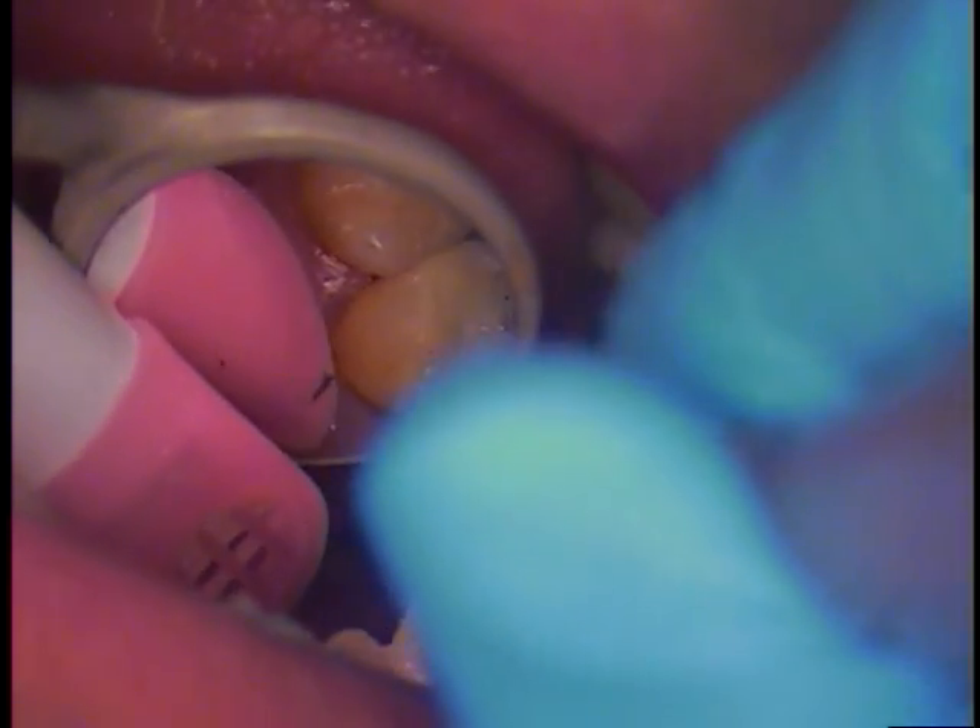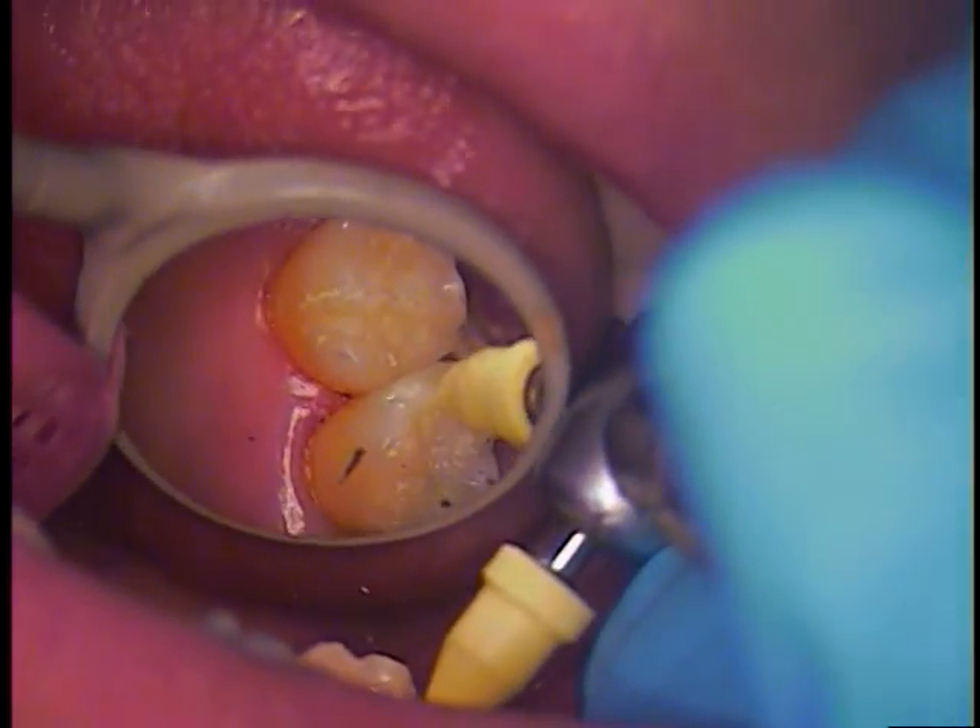I'm going to look around. This tooth, number two, definitely has a fracture.